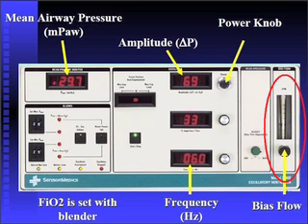Your bias flow is important when you're setting your mean, because if your flow is not high enough, you won't be able to achieve your mean pressure. I'll just add about the flow that if your flow is too high, you could create auto peep. A flow too low, and you might have difficulty removing CO2 from the circuit. So setting the flow appropriately for the patient is important.